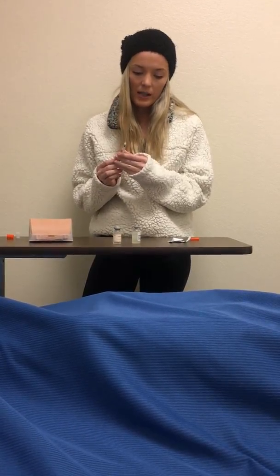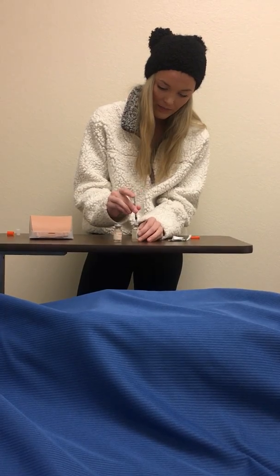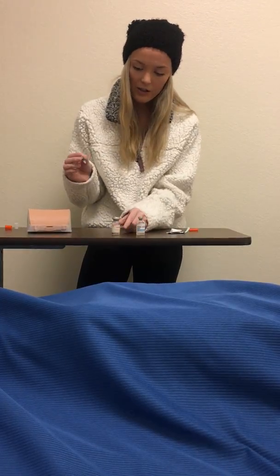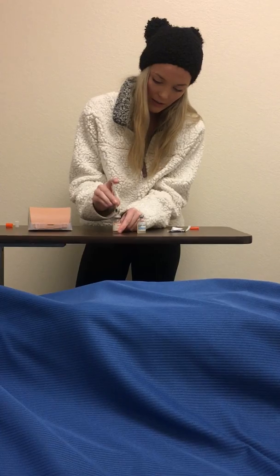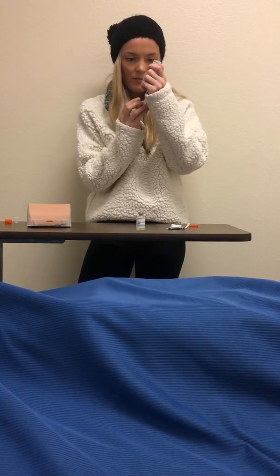For instance, if I was going to get 10 out of this, I would just draw up 10 units of air, inject that into the cloudy, pull it out, and we'll say that I'm giving another 10 of regular, so I'm going to draw up another 10 units, inject it into the regular. I'm going to tip this over and draw out the 10 units.